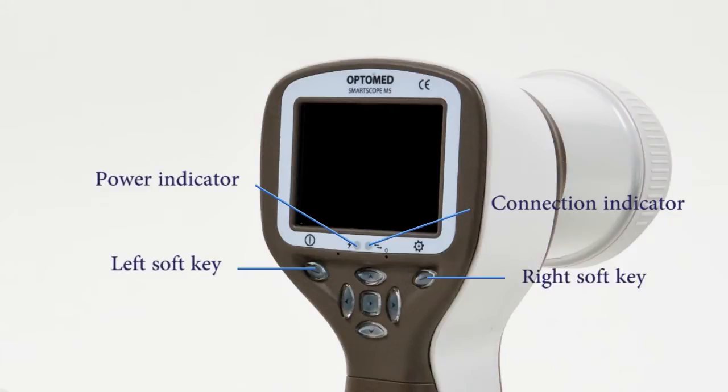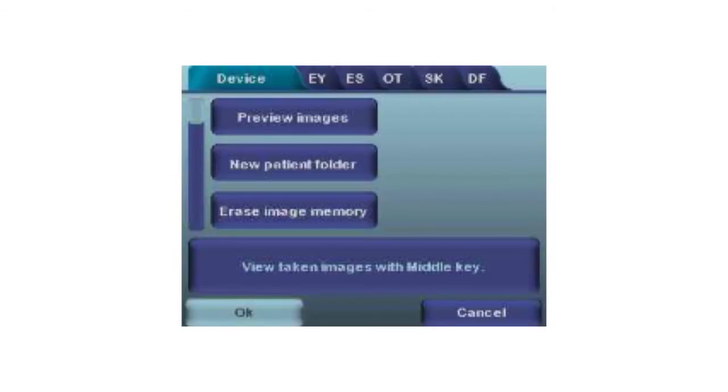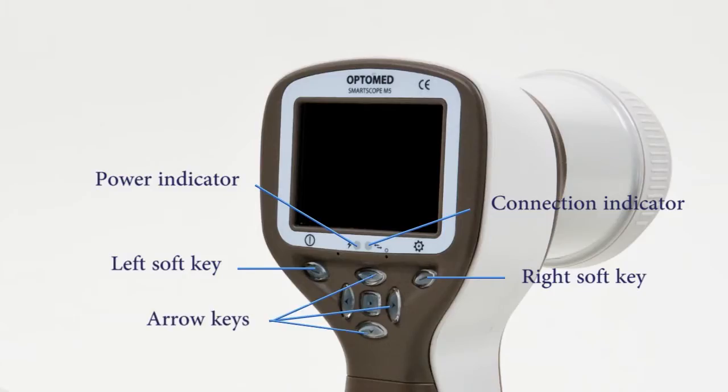The right soft key is used for opening the menu for device and image settings — press and hold to open the menu. The menu has six tabs: one for device settings, one for each different optics module setting, and also a general image setting. The arrow keys are used to navigate the menu and adjust settings. Pressing and holding the middle key creates a new patient folder, which is recommended when multiple patients are examined without transferring images to a PC between examinations.